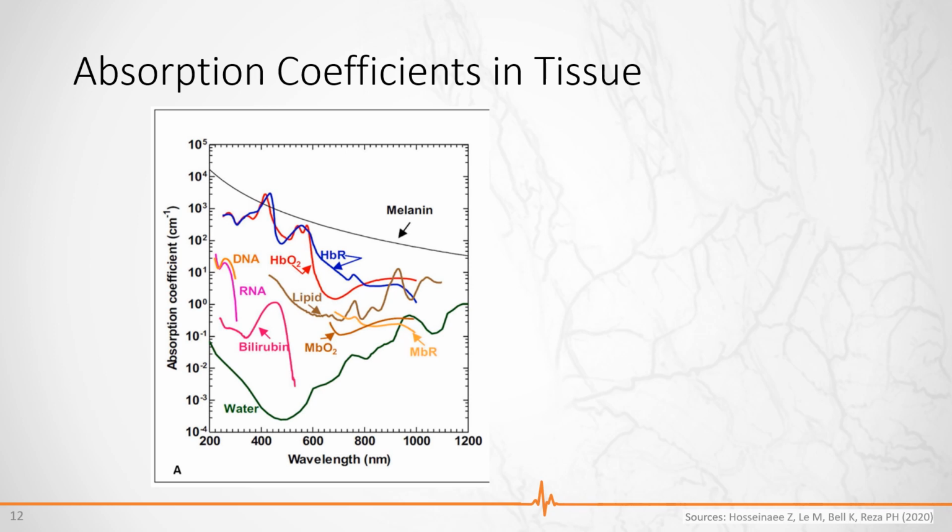And additionally, water creates noise everywhere, and depending on the absorption strength of the target, this could be a problem for the contrast.